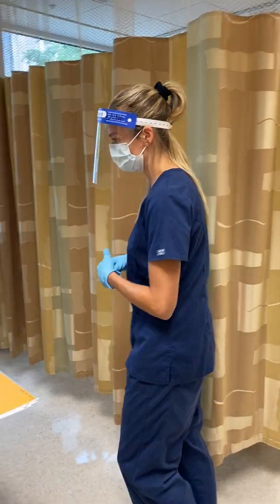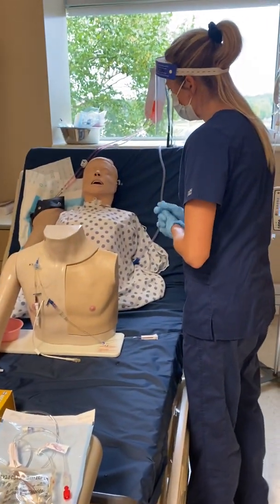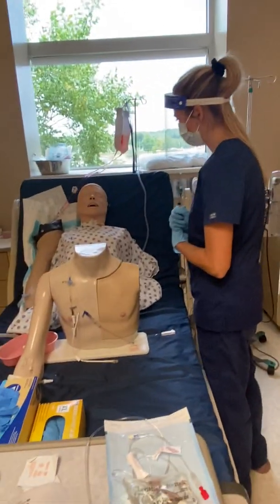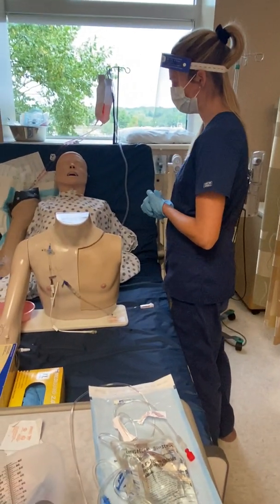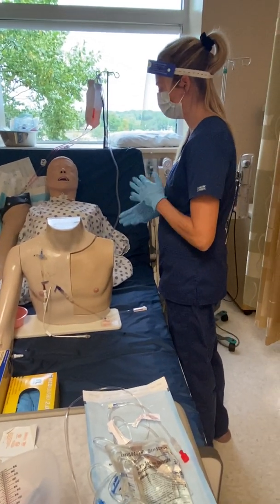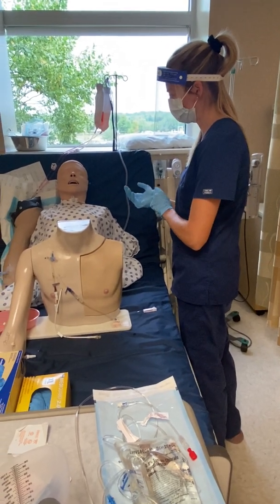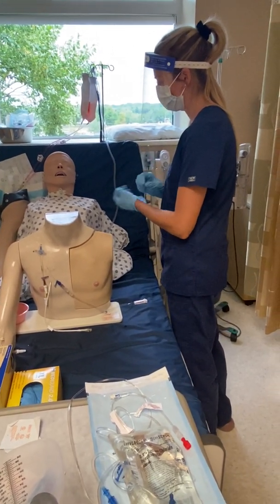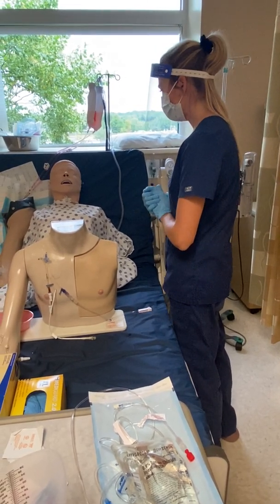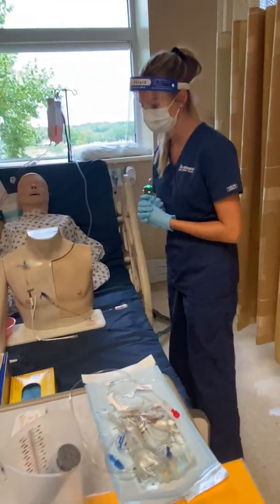Knock, knock, knock. Hi, Jane. My name is Lane. I'm going to be your nurse today, and I understand that you are feeling kind of nauseous, and I see you have a little bit of low blood pressure, and then you also need an NG tube inserted today. So I'm going to get all of that going for you. Besides the nausea, are you feeling okay? Are you feeling anything else? She says no, she's just nauseous.